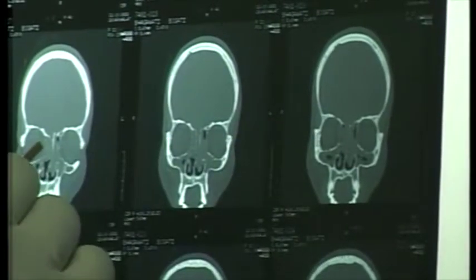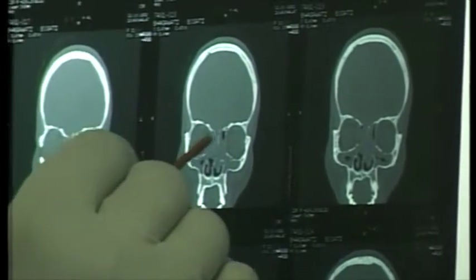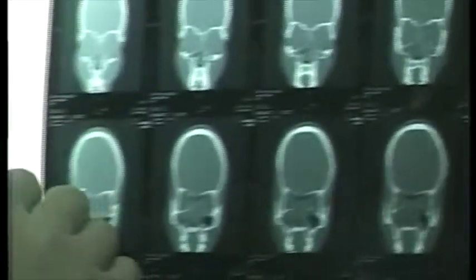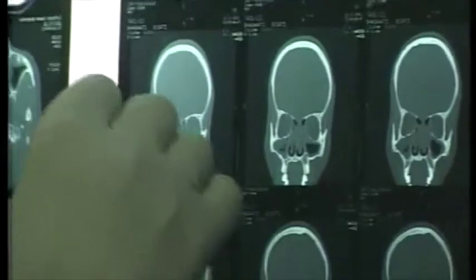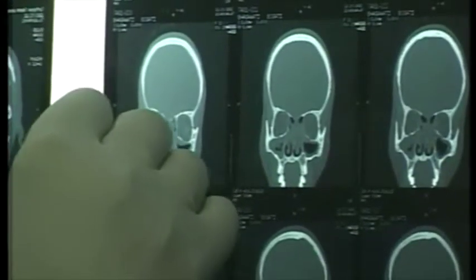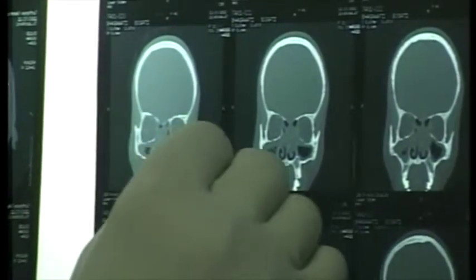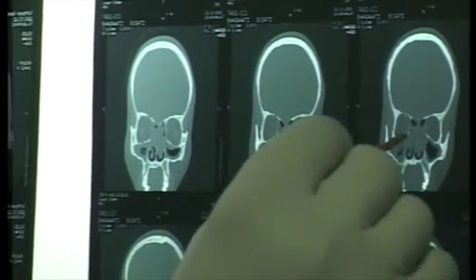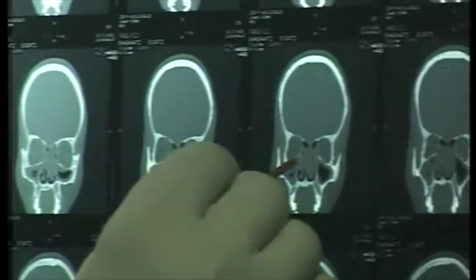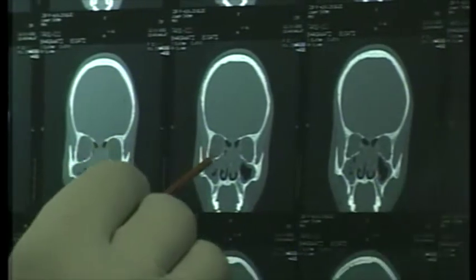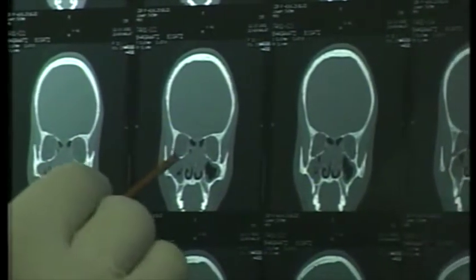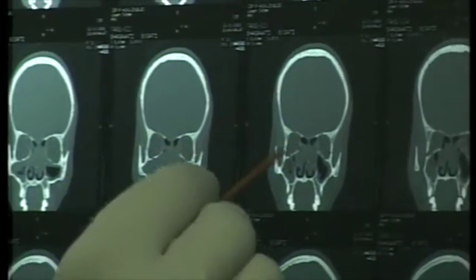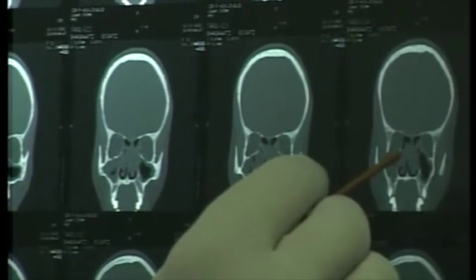Here you can see the base of skull - very thin. All the maxillary sinuses and ethmoidal sinuses are opacified. The middle turbinate is becoming horizontal, and the ground lamella and posterior ethmoidal air cells are seen - they are also diseased. It is almost a pansinusitis involving all the sinuses in the nasal cavity.